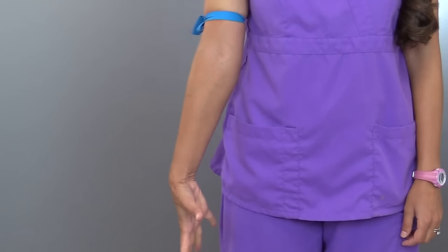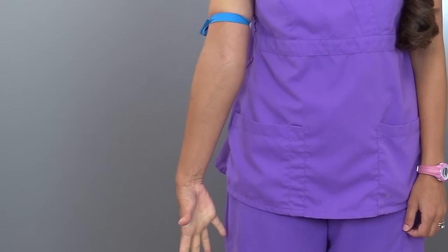What I like to do is put the tourniquet on the upper arm — not too tight, but not too loose, just right. Have the patient drop the arm by the side and pump that fist, just open and close that hand over and over. This gives time for blood to pool in the lower part of the arm so you can increase your chances of getting a vein. It's really amazing how taking the time to do those two simple things really does work.